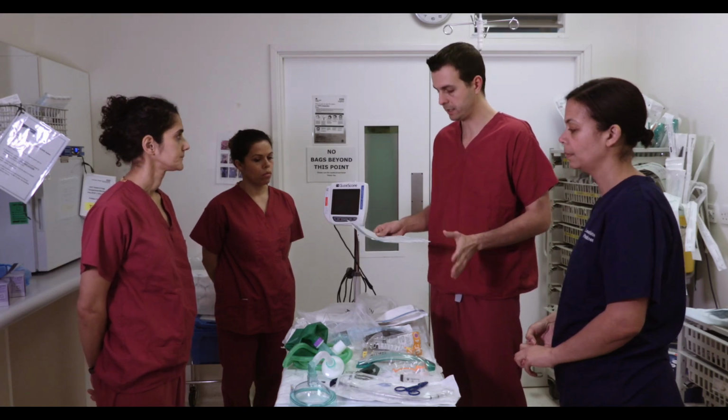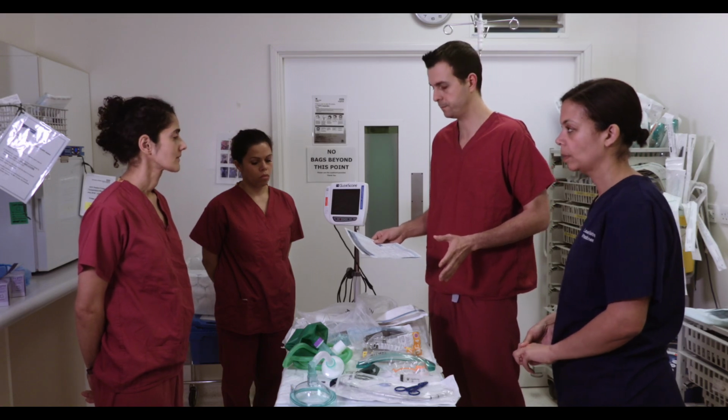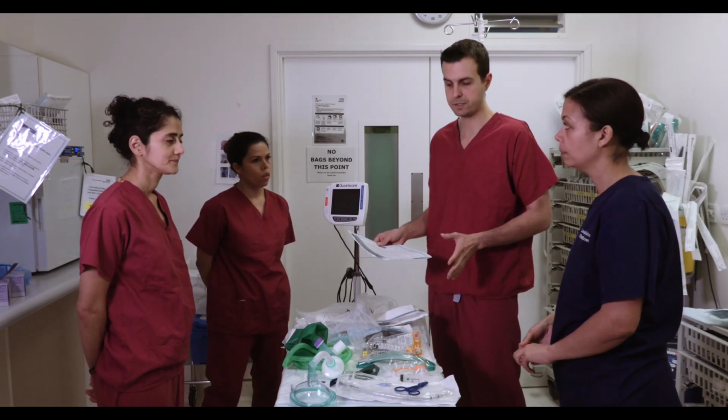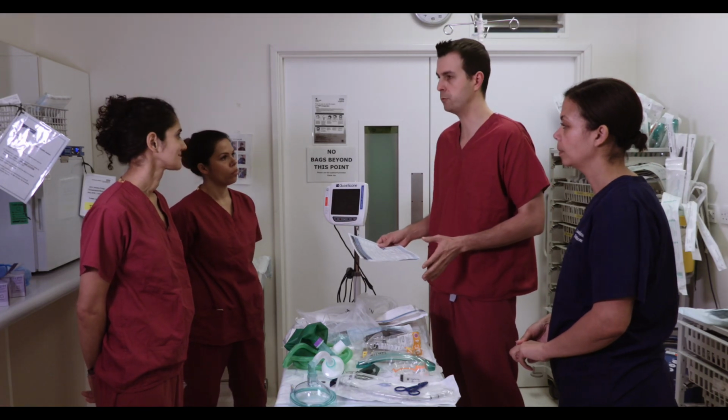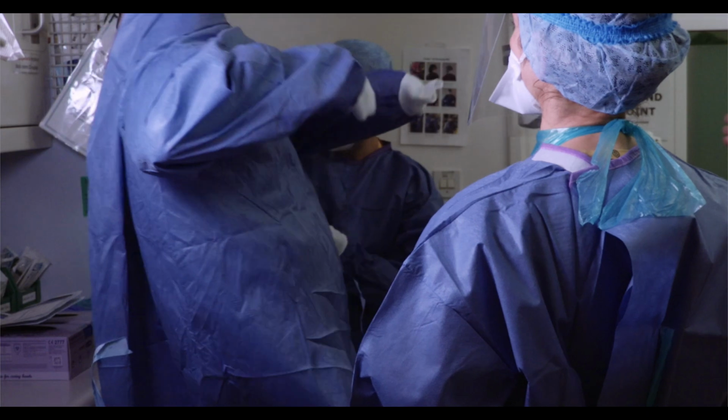And we're going to connect then to the Oxylock. We'll make sure that we always have an HME filter connected. Yes. Excellent. So the next step is to get dressed up in our PPE. 4. Prepare yourselves. Please refer to current guidelines for donning for aerosolizing procedures.